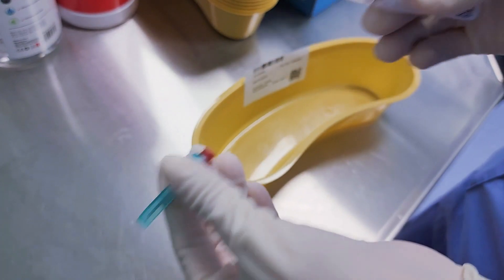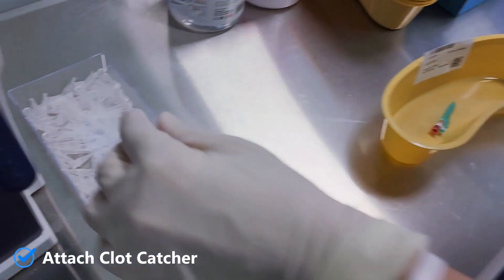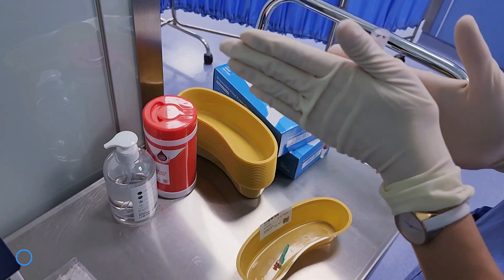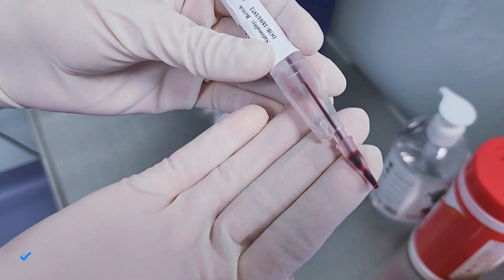Remove any capillary cap and place a clot catcher in the end of the tube. Ensure that the blood sample is well mixed before the test.